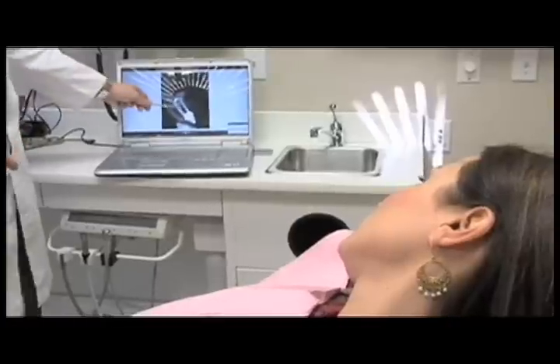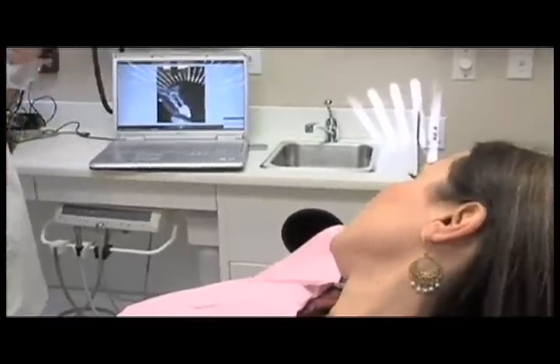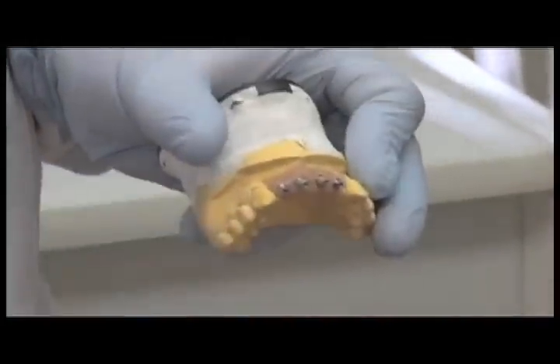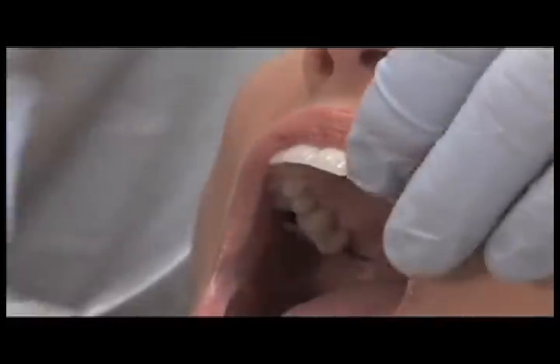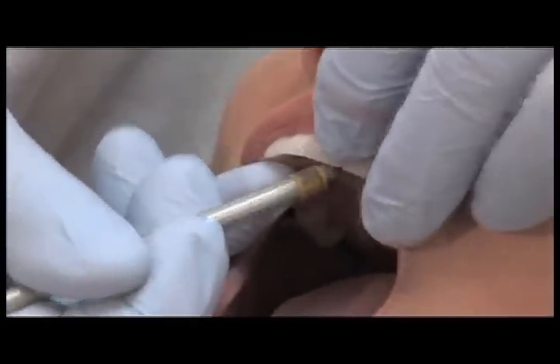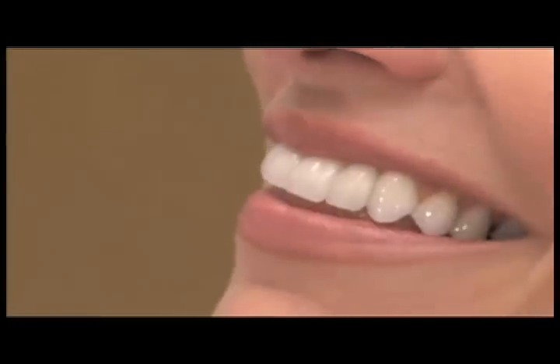I was able to virtually place the implants and restore the teeth, actually make teeth, before we ever touched her. We placed our implants and gave her teeth that same day. In about an hour, she left the office with her smile intact.